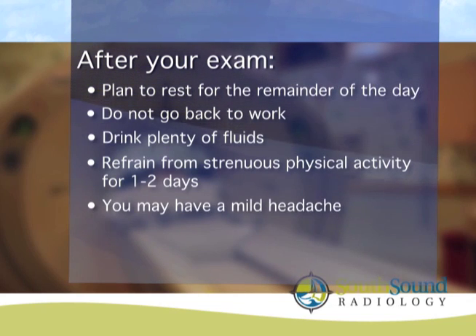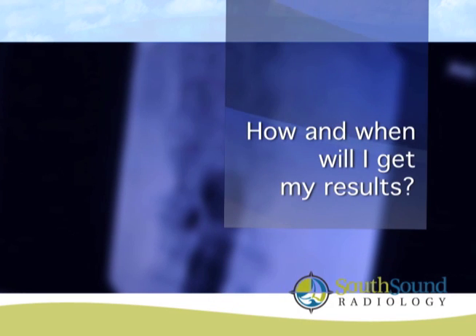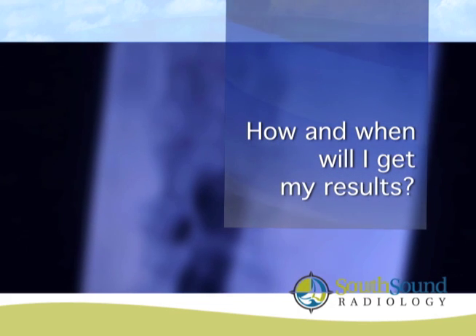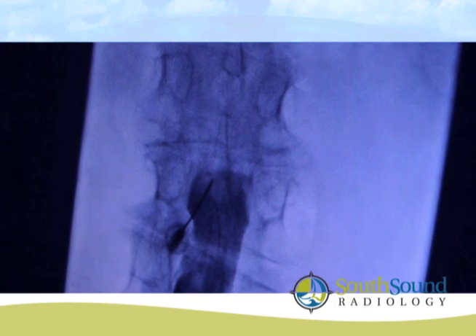It's normal to have a headache following the procedure, but a severe headache for more than 24 hours, neck stiffness, or numbness in your legs should be reported to South Sound Radiology by calling 360-493-5539. You will also receive a copy of these instructions following the procedure. A radiologist, a physician specifically trained to supervise and interpret radiology examinations, will analyze the images and send a signed report to your referring physician, who will discuss the results with you.